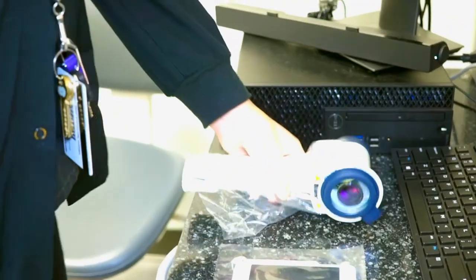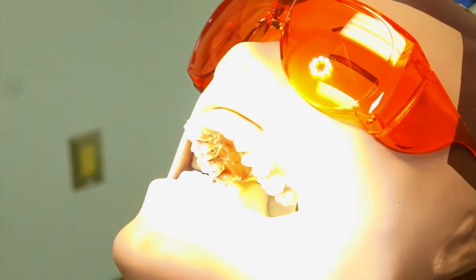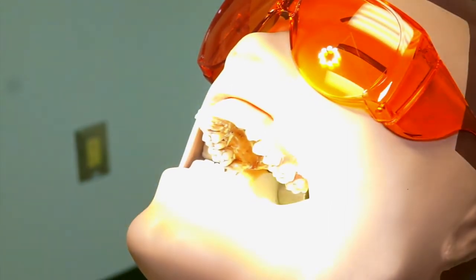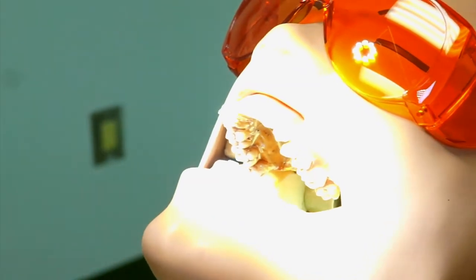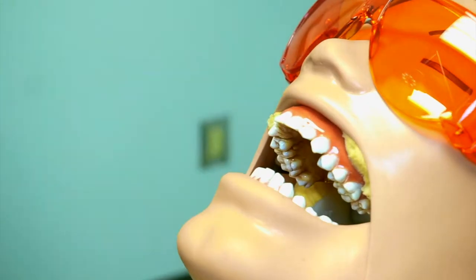Instruct patient to wear protective eyewear provided with the Bellscope. Prepare room for use of Bellscope by turning off operatory light and blocking out as much room light as possible.